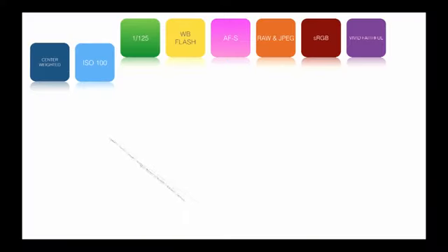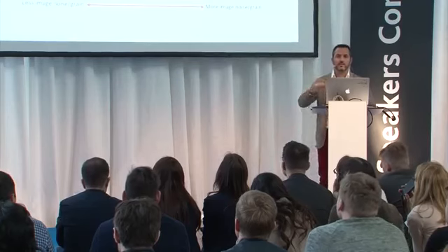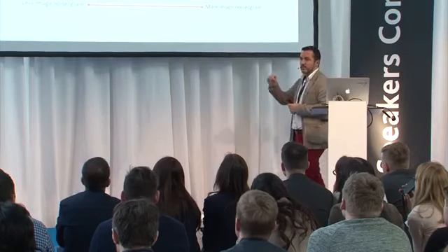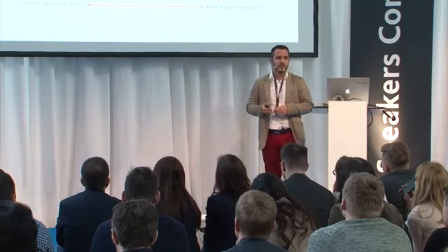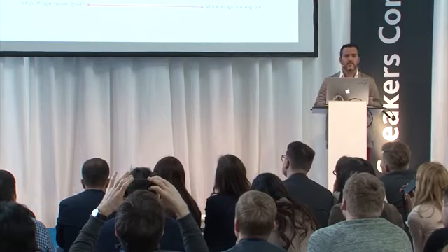Then, ISO 100 is about the sensitivity of the sensor to the light. It's about how much light the sensor will absorb. This is the native capacity of ISO 100, and I always keep it this way. I never change it, because I always want to use artificial light. So I'm using twin flashes or studio lights, but I always give artificial light for my picture. So I will keep it at 100. If I increase this number, I will get noise in the picture, you know, the small dots, the small particles there. So you don't want to have that. And that's why we keep it at 100. Then we are going to have clear and sharp photos.